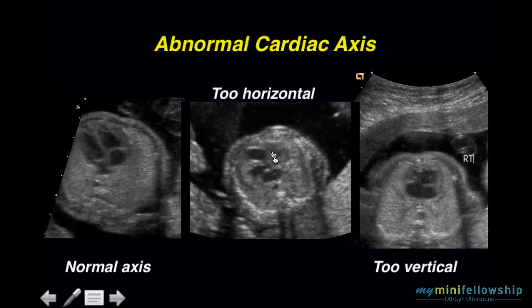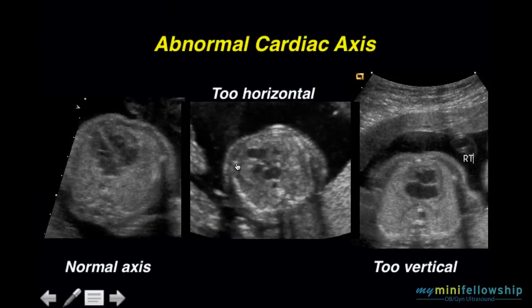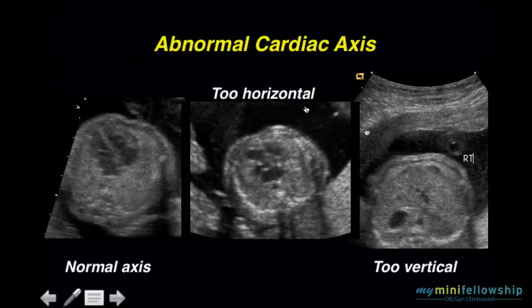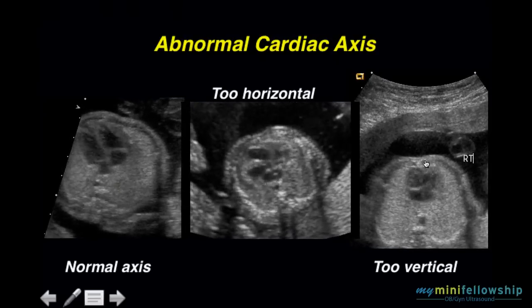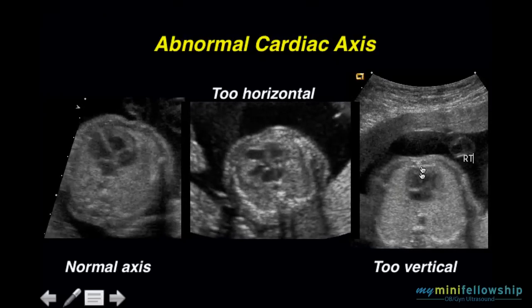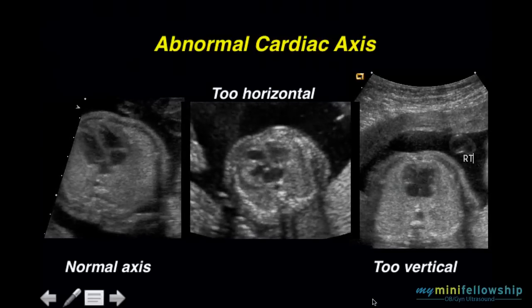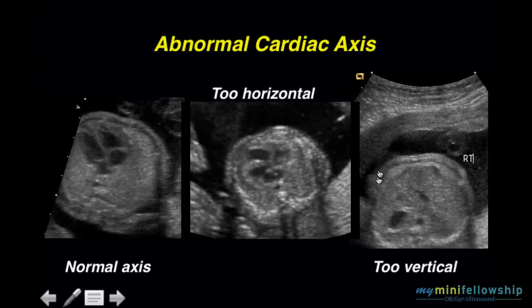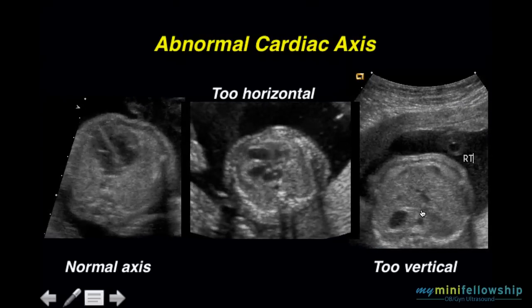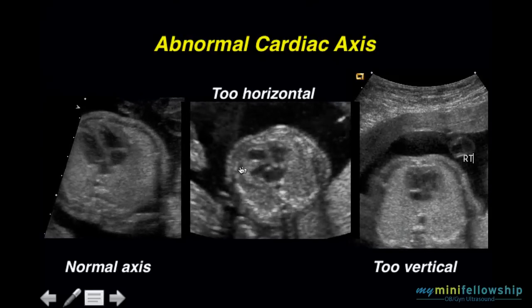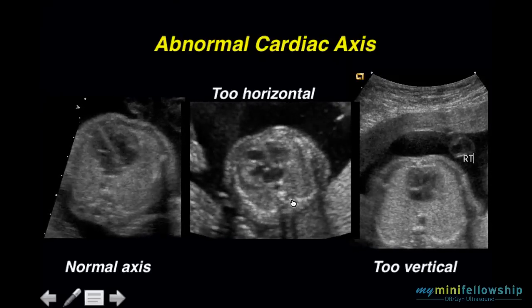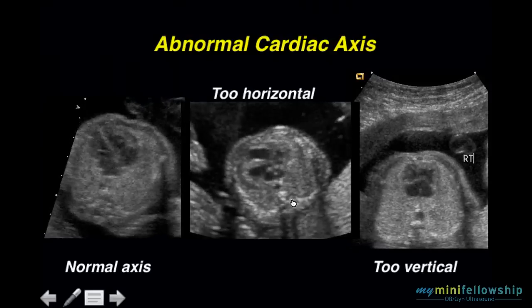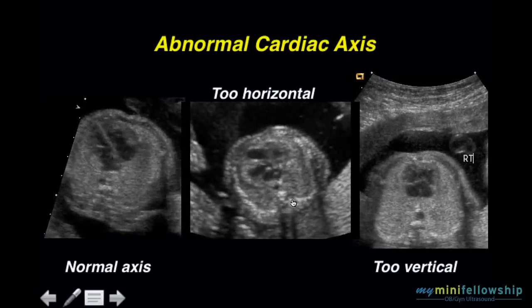Here, we draw our midsagittal plane and a line through the interventricular septum, and clearly the heart is too horizontal. Here, we draw our midsagittal plane and a line through the interventricular septum, and clearly the heart is too vertical. This fetus has a congenital structural defect of the heart. This fetus has an acquired cardiac abnormality.